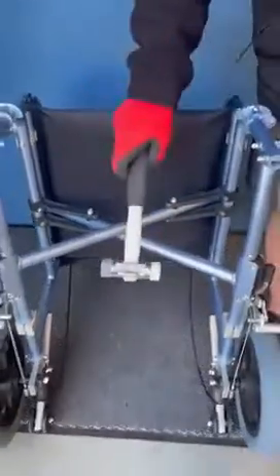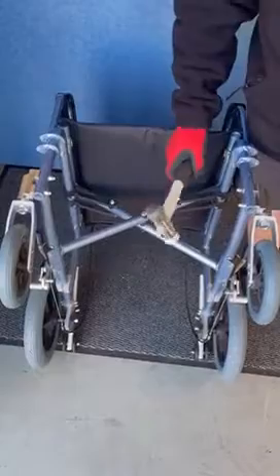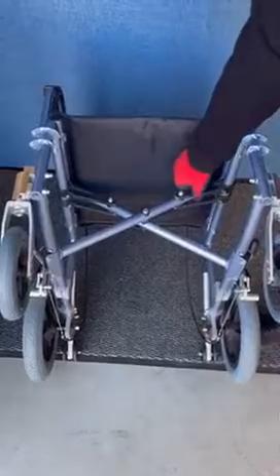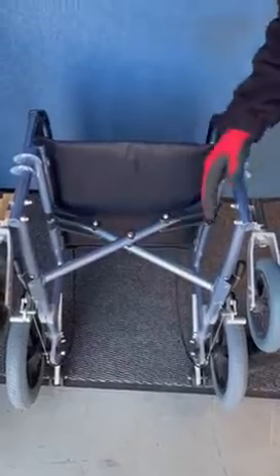To rectify this problem, you will need a nylon hammer, very similar to this, or something similar, so you don't damage the chair. And what you need to do is knock that down, and at the same time, you'll need to knock those down, bringing the chair back into alignment. It might be these two and this one, or it might be this one and these two. Depends on which side is misaligned.